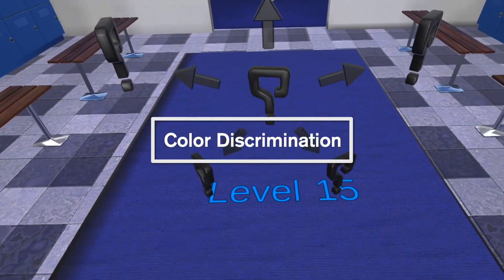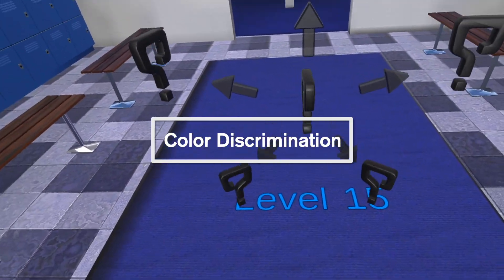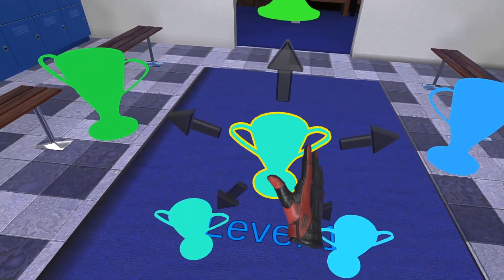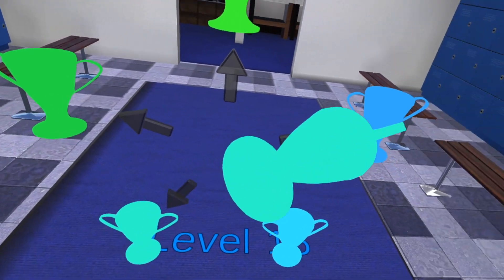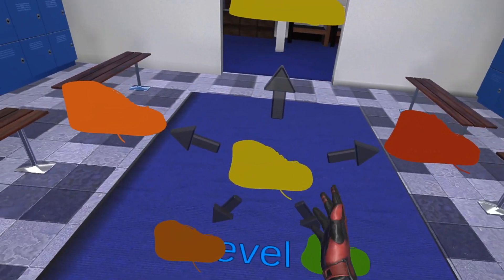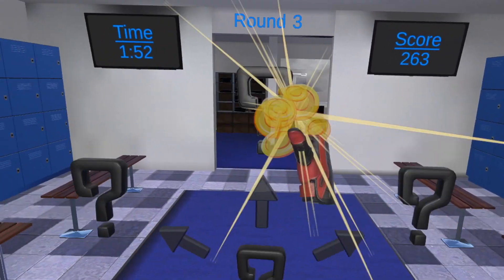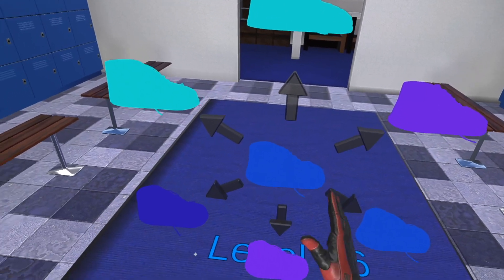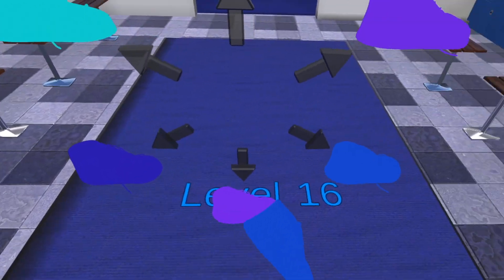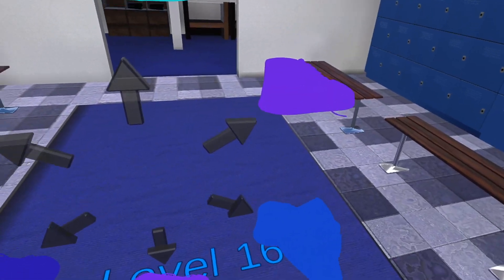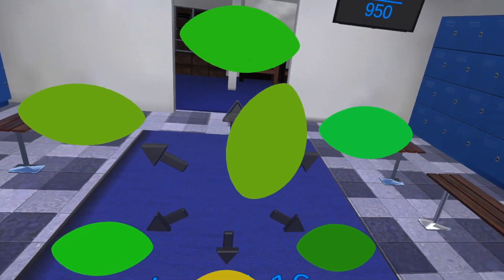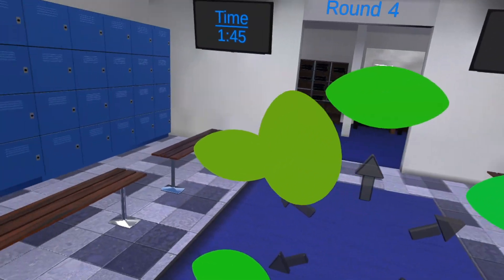Next we have Color Discrimination. This is a color matching game. The objective is to grab the object in the center with the trigger and match it with the object in the periphery. The Easy, Medium and Hard settings adjust the number of targets you have to match.